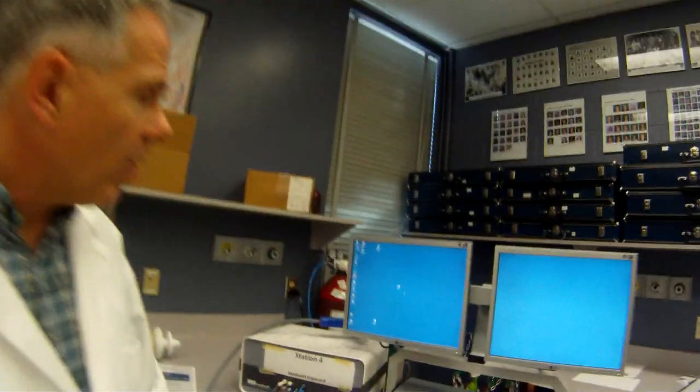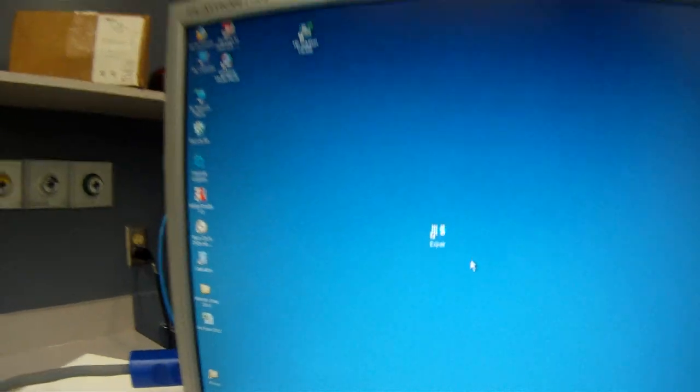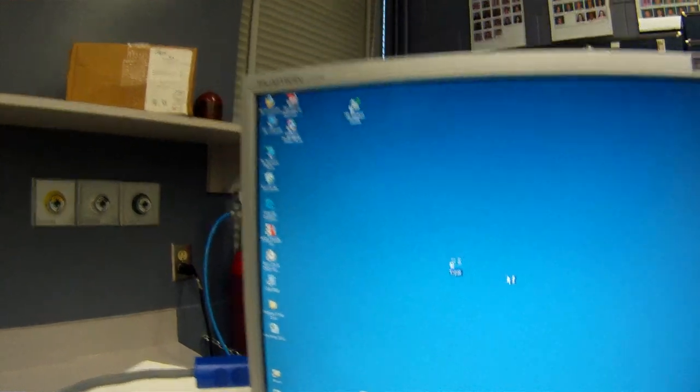All I'm going to show you how to do is basically how to get the software up and running and how to do a calibration. So let's take a quick look here. First thing you need to do is we've got to click on the Xpire software, get that running.